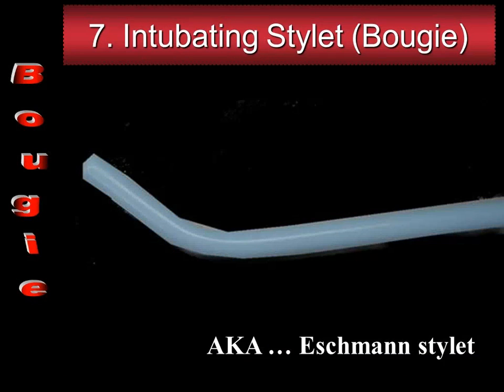They have a newer bougie out there that I like, that you can actually coil up, and it's more flexible, and all that stuff. So really, you can crank down and make a nice hockey stick if you know that they're going to be a real anterior person. So you should always know where your bougie is. Too many times it can save your butt.